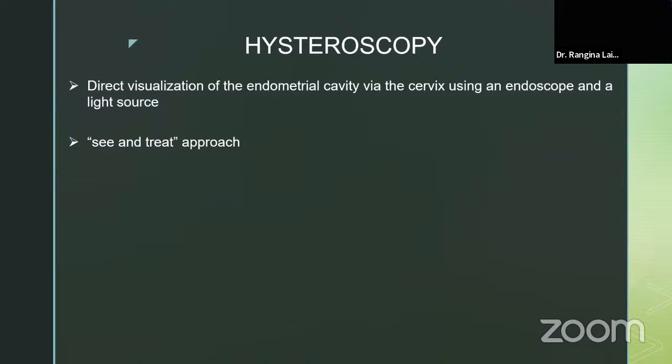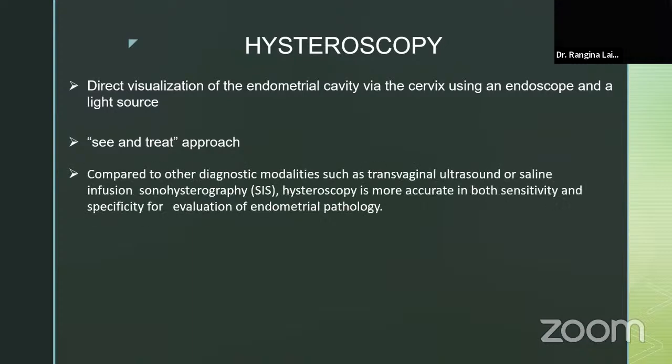So a little bit of the scenario in Nepal. It's a very alarming stage even in Nepal, because there are lots of doctors who are doing hysteroscopy, but basically what is hysteroscopy? We should know that. Before touching the scope, we should know that it is not only seeing the pathology, it is about seeing and treating the pathology.